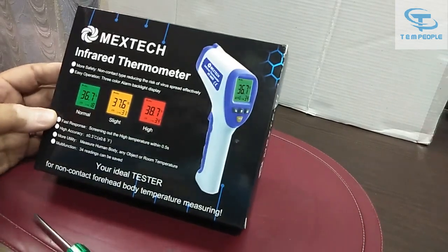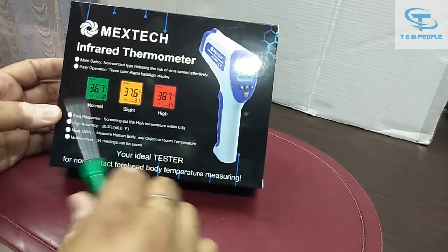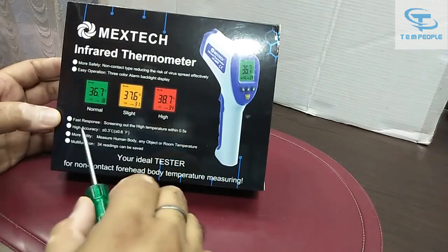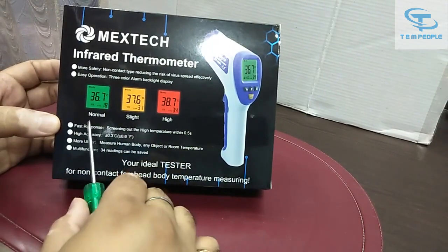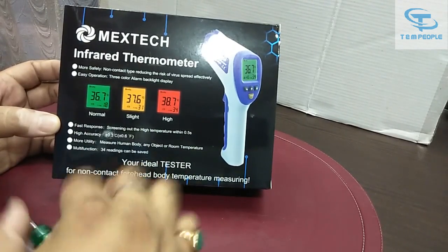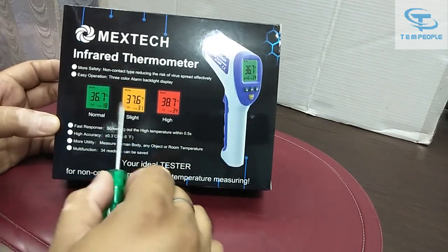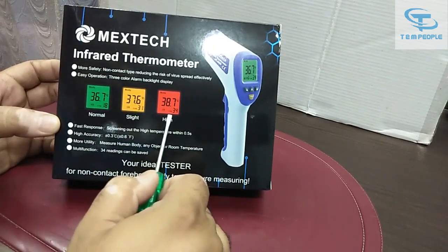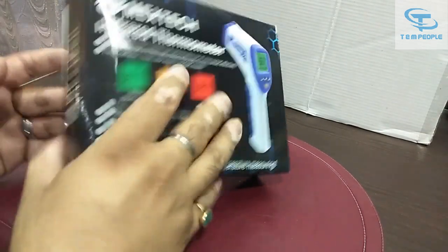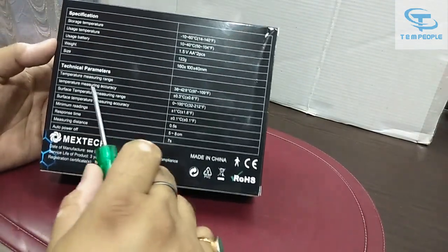This is the meter I received from Mextic. You can see there are three colors indicated on the box. If there is a normal reading, it will show green. If the temperature of the human body is slightly elevated, it will show yellow. And if the temperature is high, it will show red.